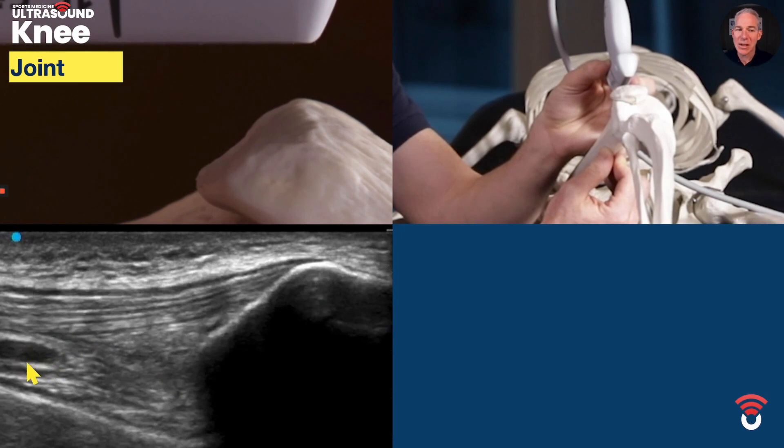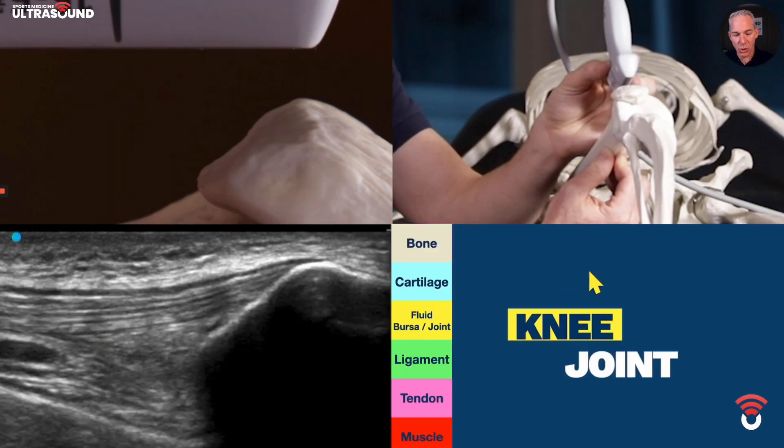This is a little bit of fat here. The hypoechoic area we can't actually see it in this view — you'll see it in a section coming up shortly.